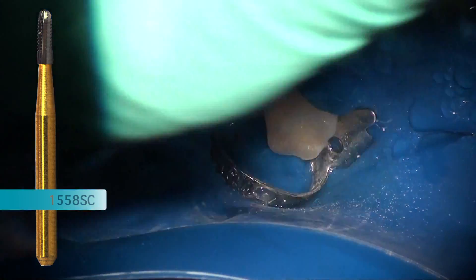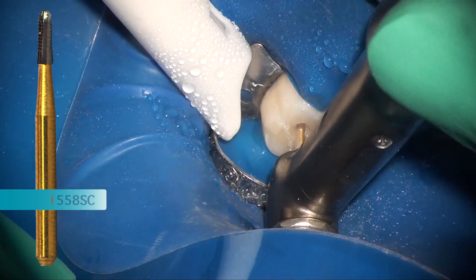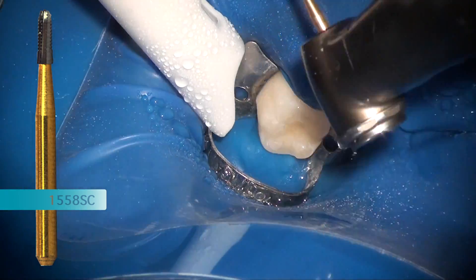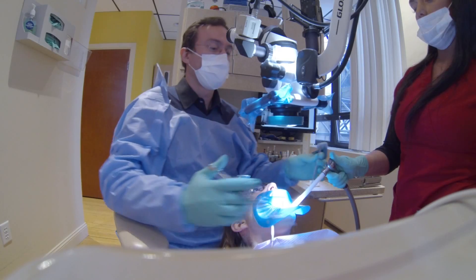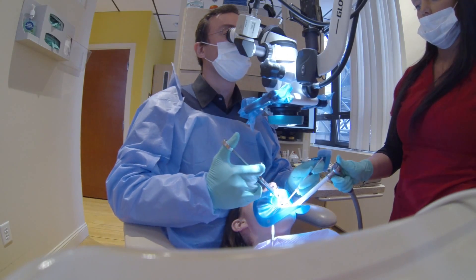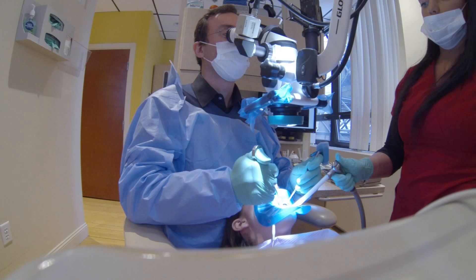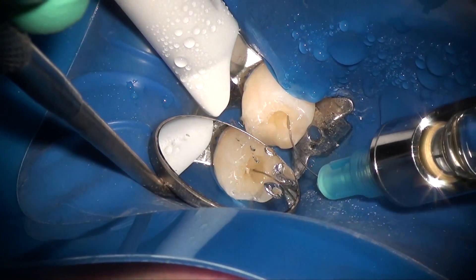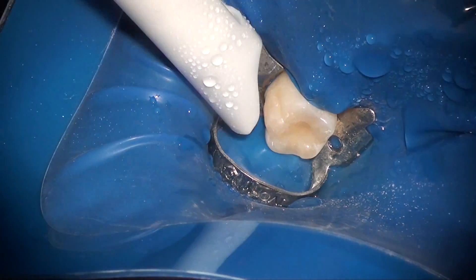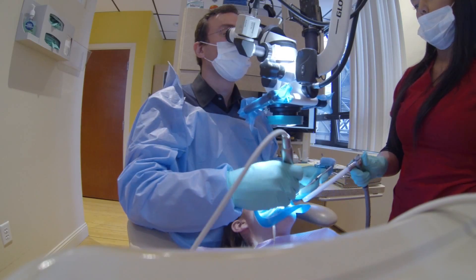My goal is to always just nick the pulp quickly and then follow that up with an intrapulpal injection. At this point it's important to notice that the patient is completely numb — they are not feeling the intrapulpal. The intrapulpal at this point guarantees that the rest of the procedure will be eventless. At the same time, the epinephrine in the anesthetic will decrease the hemorrhagic, inflamed pulp — especially in these emergency cases.